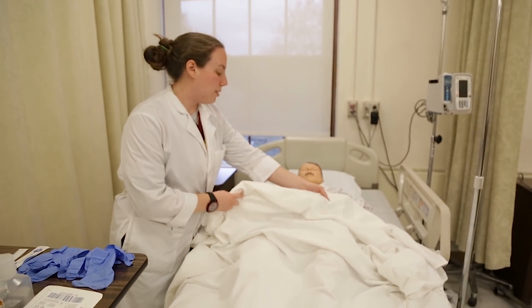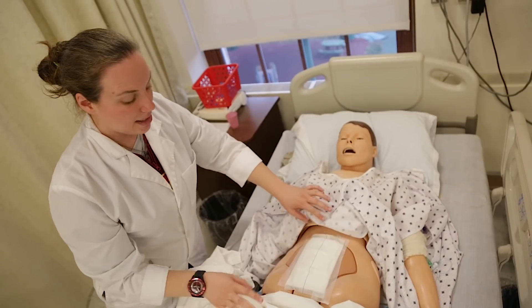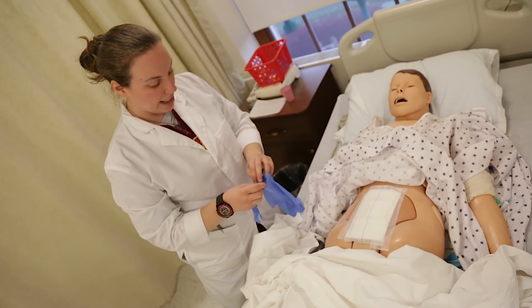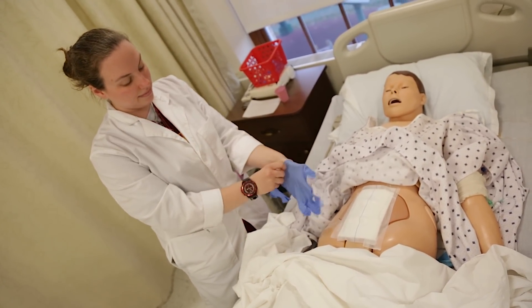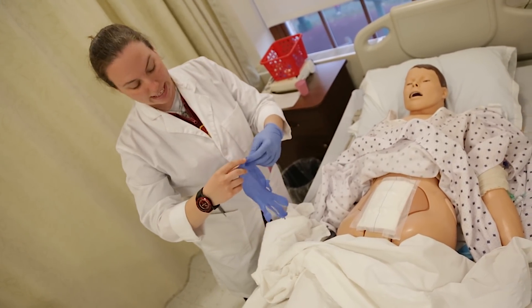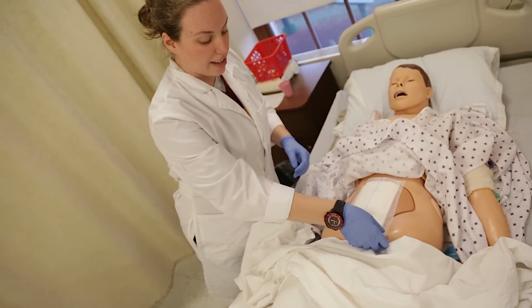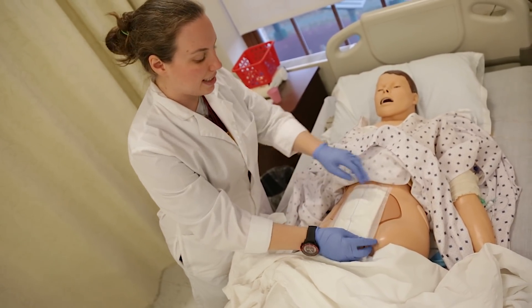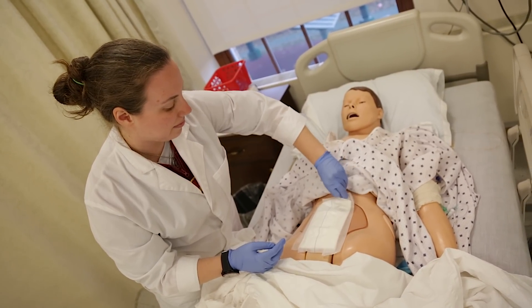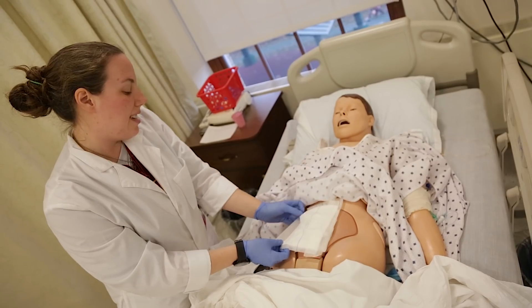Mr. Maxwell, I'll be bringing down your blanket and revealing your abdomen. This is what we'll be changing right here. In order for me to start changing, I need to take off the old dressing. So I put on my clean gloves — the first of many. Once those are on, I take off the wound dressing. I usually start at all four corners because opening the ends doesn't hurt as much.